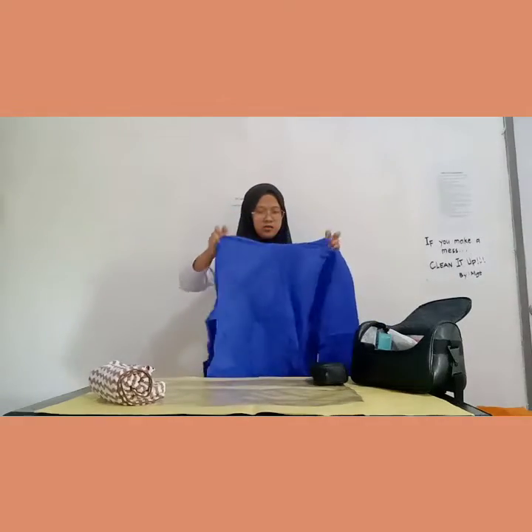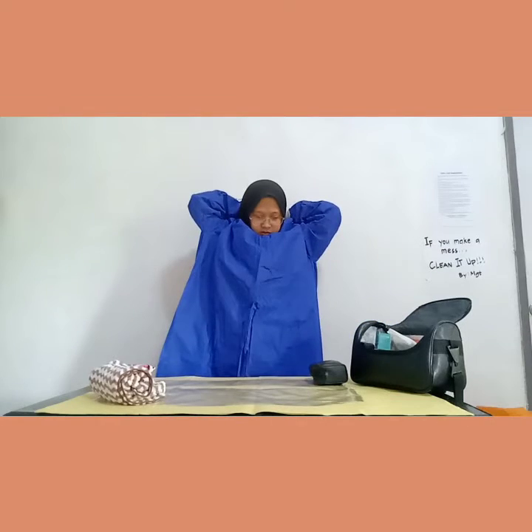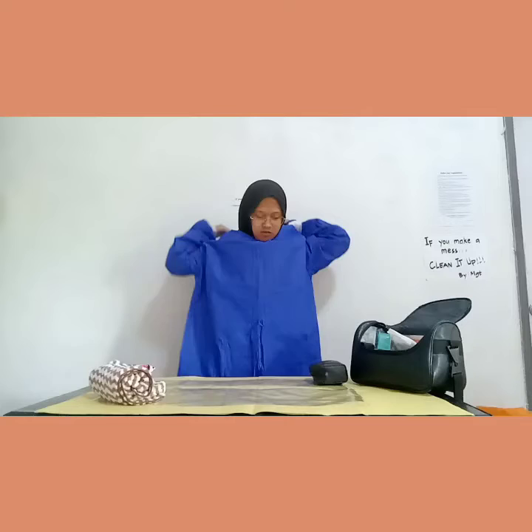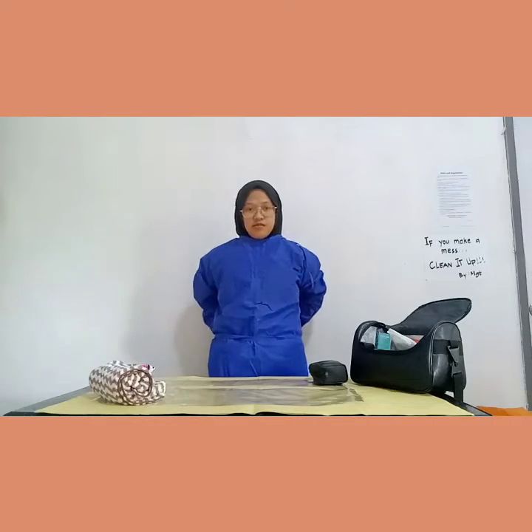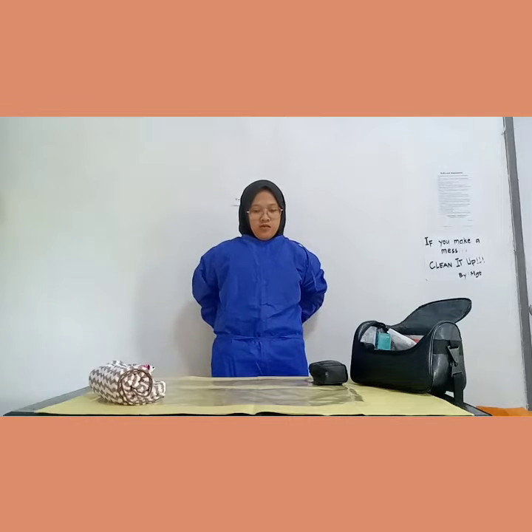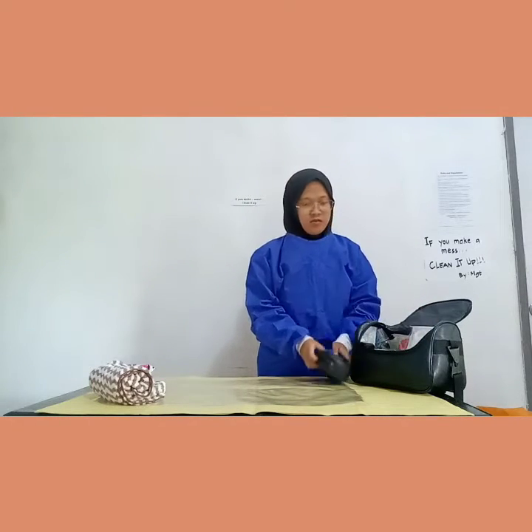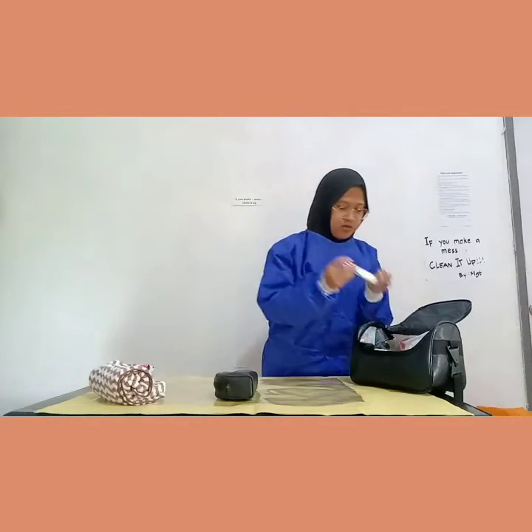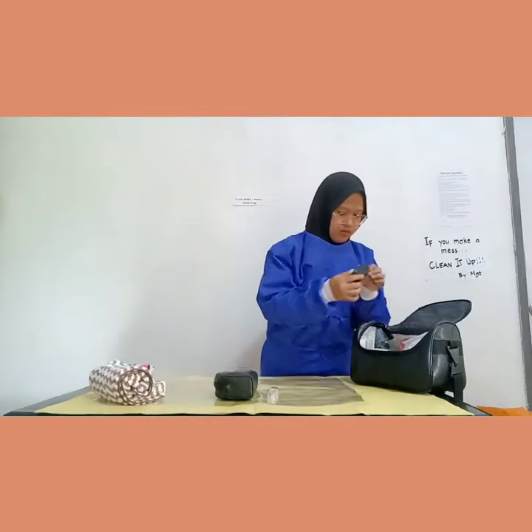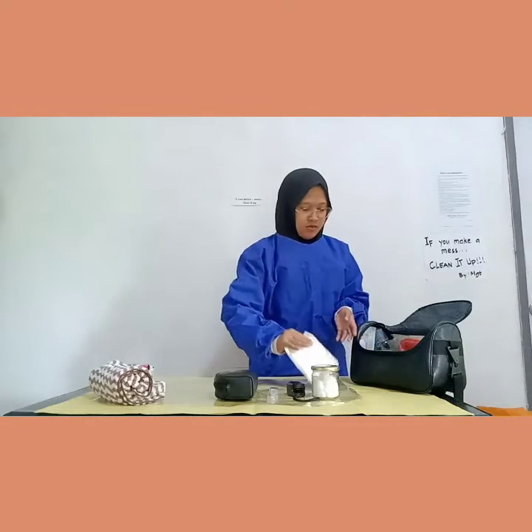This is to make sure that the apron is put on tightly. Take out the things most needed in rendering nursing care, for example, thermometer, kidney basin, cotton balls, and waste paper bag, and place them at the corner of the work area. This is to have an organized work and also to save time and effort.